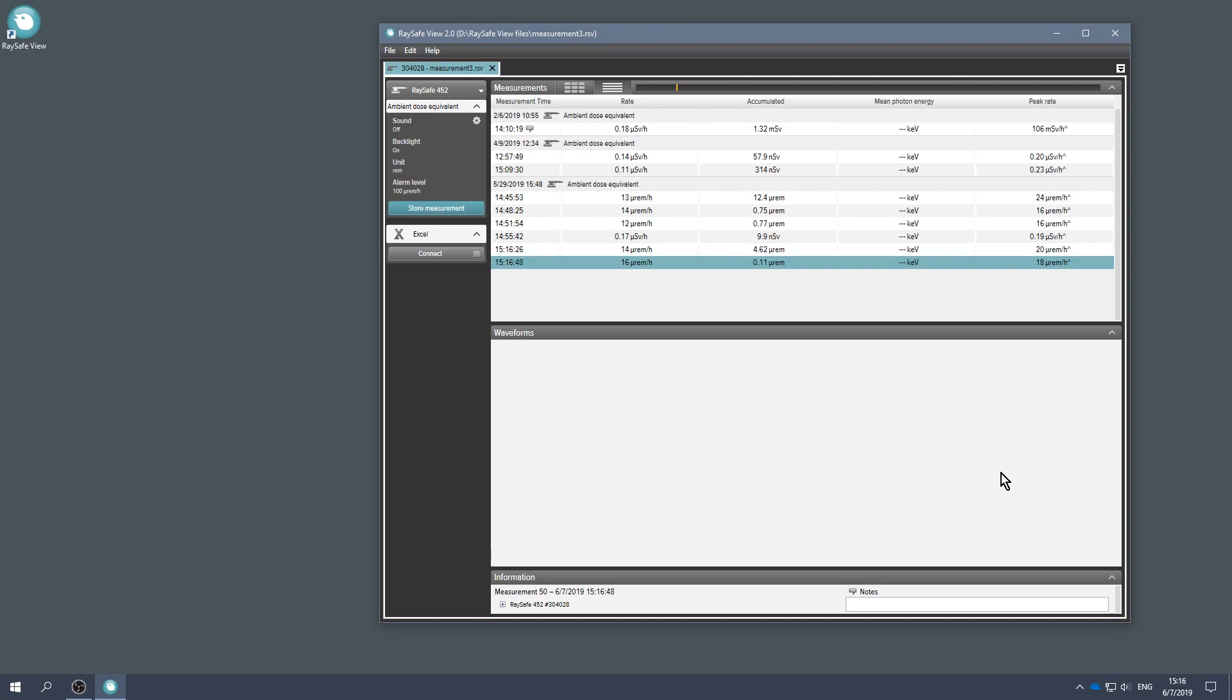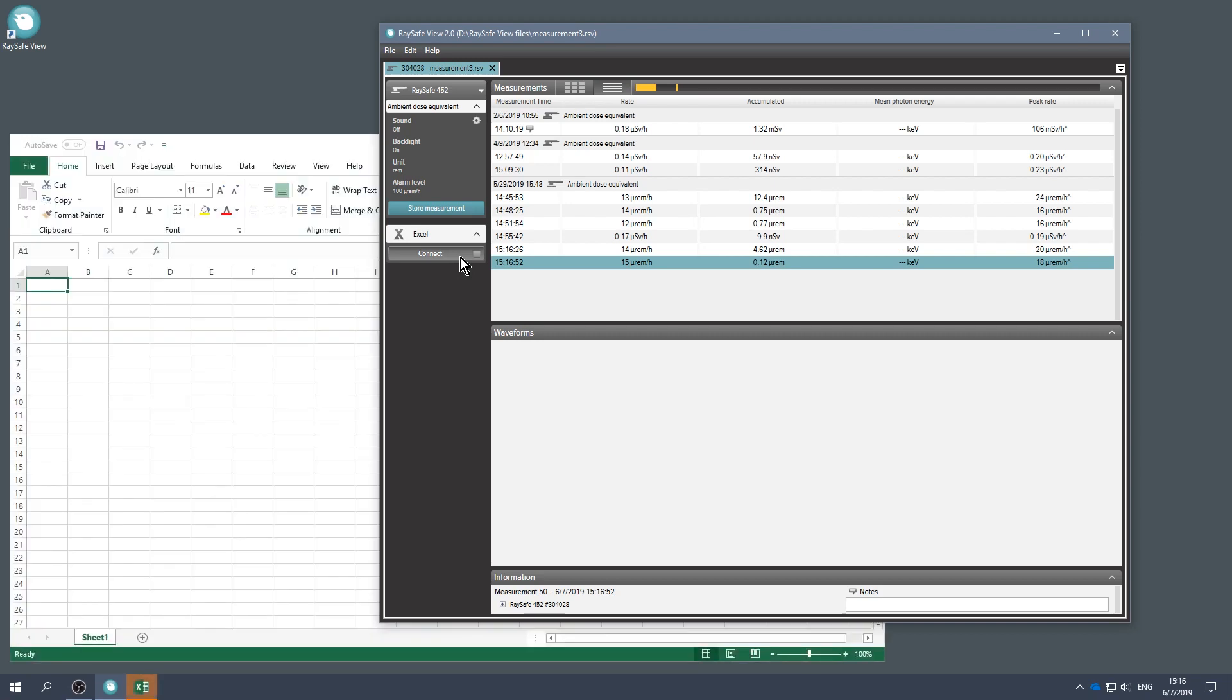You can also export data to Microsoft Excel. Click Connect in the Excel panel, then click Export.